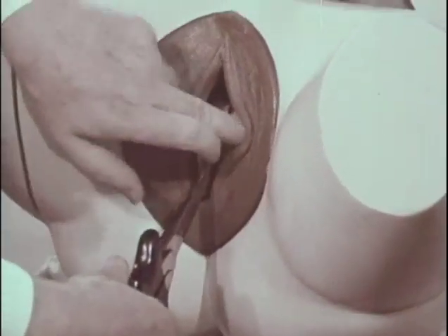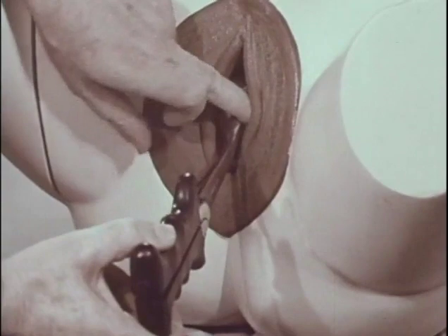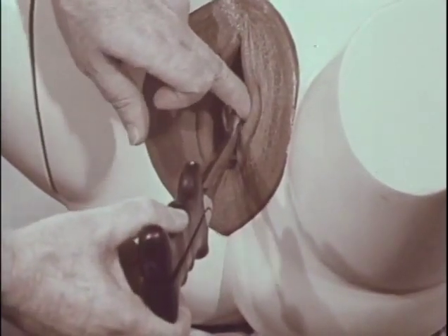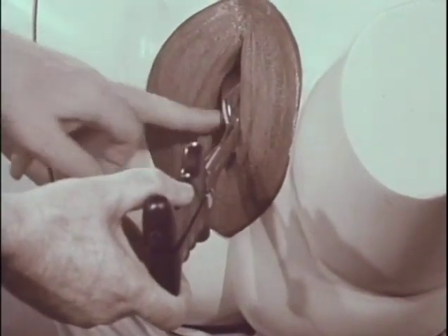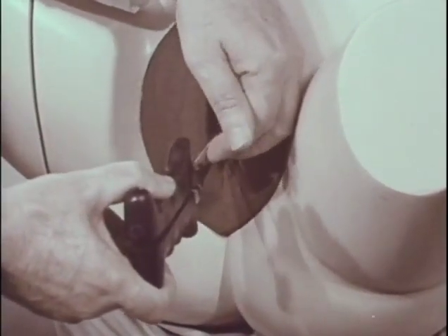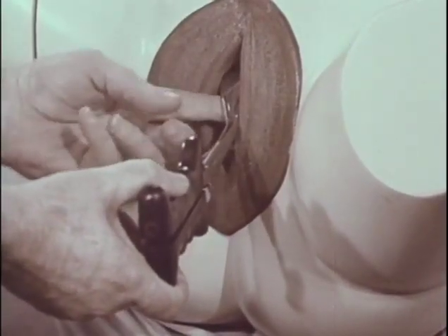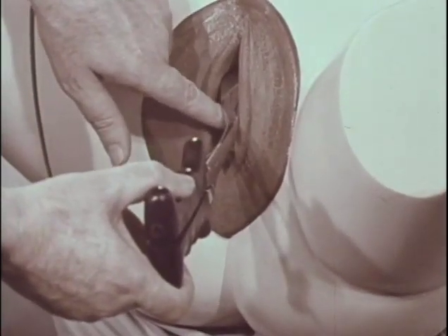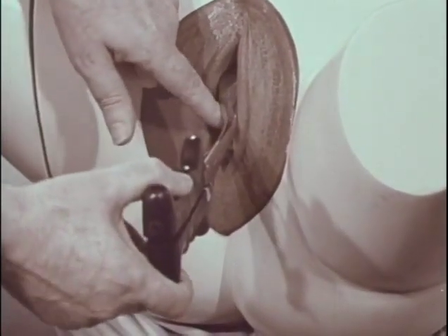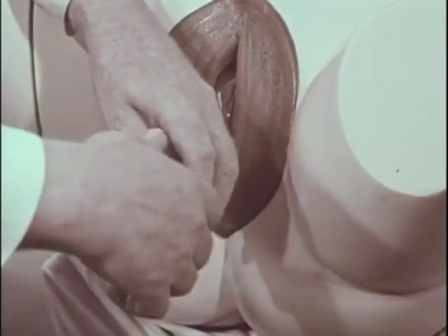Next, we check our application, and we find that our handles and the plane of the shanks is within a finger's breadth of the fontanelle, which is desirable. The sagittal suture runs transversely and is at right angles to the plane of the shanks. Of course, no fenestration is felt on a solid blade, but the head is filling the space between the heels. So we're ready now for the instrumental rotation.